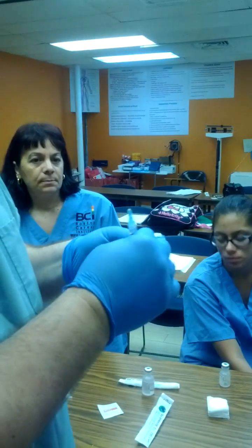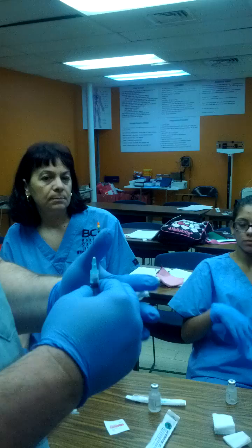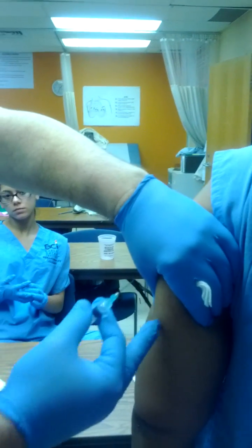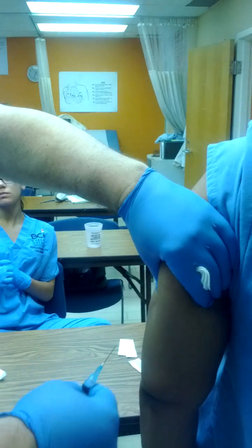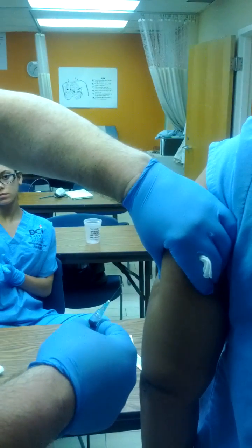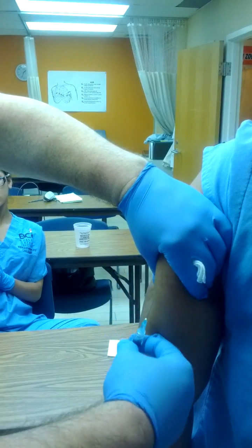I'm going to take a couple of pieces of gauze and stick it between my index finger and my middle finger of the left hand, and I'm going to grab this fatty tissue right over here. I'm going to take my hand — my hand is upside down again — and give her a big grab right over here. Every part of this area I know I cleaned, and the only thing I have to do now is go straight up into this bulge right over here.